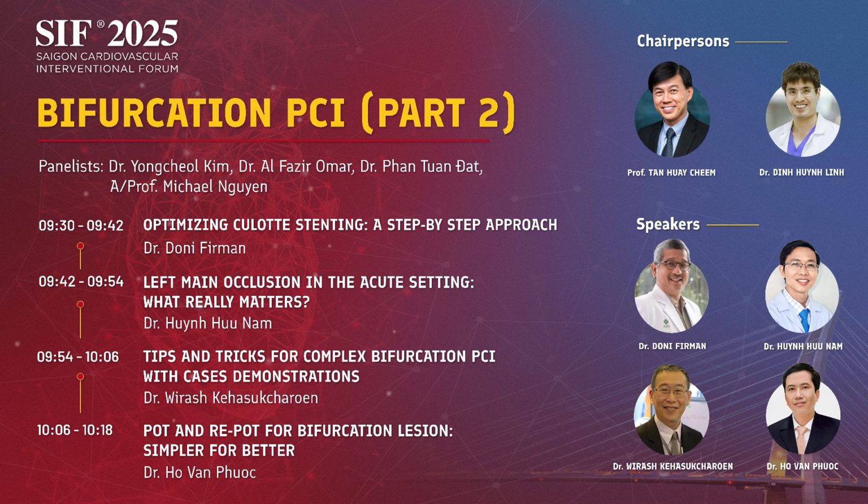But in your case, with the small balloon you send, you aim to do the jailed balloon as well. Maybe that's just a good idea, but sometimes you have to pre-dilate, that is, the ostium modification. Sometimes, if the lesion looks too aggressive, and the side branch is most important, I use the rotator to cut. To cut the stent, yes. No, to cut before the stent. Because I think everything should be prepared well before stenting. This is my very important thing.